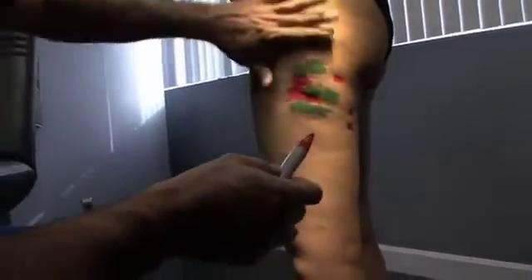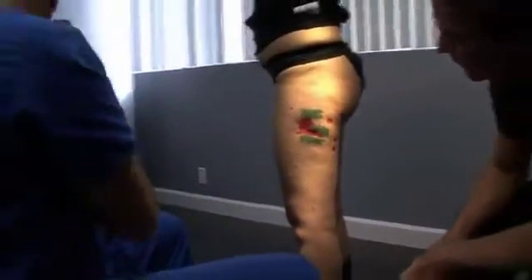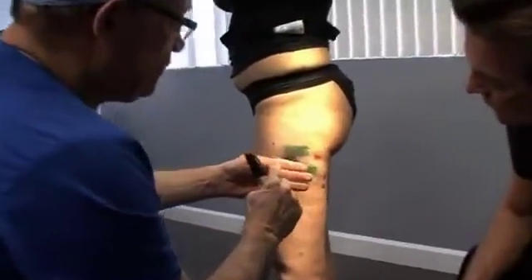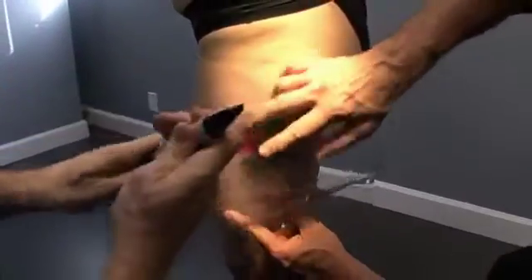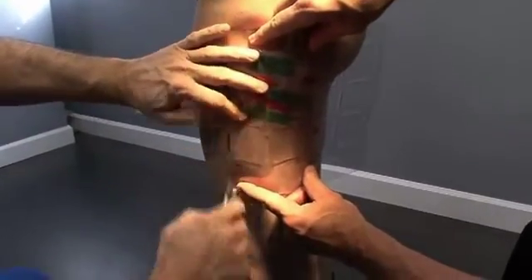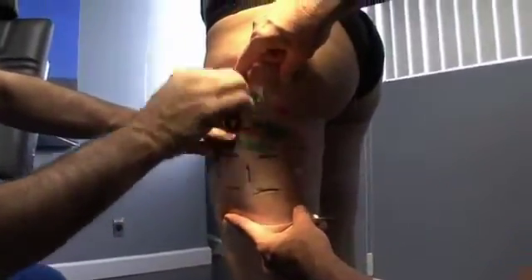So at this point, we look to see that we have a smoothness everywhere else, or mattress pattern cellulite everywhere else, which we do. So we've gotten our raised areas, our depressed areas. Now we're going to apply the grid, and this is a grid of the 5 by 5 centimeter squares. And if you want to just hold the other end there, we used to do this freehand, but now we have a nice template, and we're going to go ahead and make our squares around all the borders, because all of our energy settings are based on 5 by 5 centimeter segments of energy.